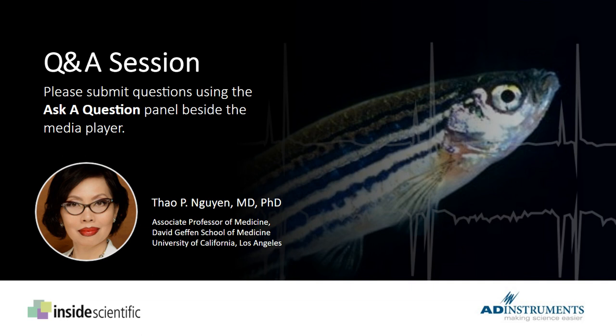If you're doing single lead ECG, I would just play around with one lead, moving one electrode, not both electrodes at the same time. You keep one electrode fixed. Let's say you keep the negative electrode fixed and you move the positive electrode, and so on, until you can increase the voltage signals a little bit more. Yeah, but I'd say just practice makes perfect, and then you'll get the hang of it.